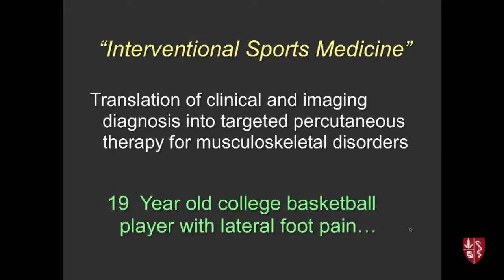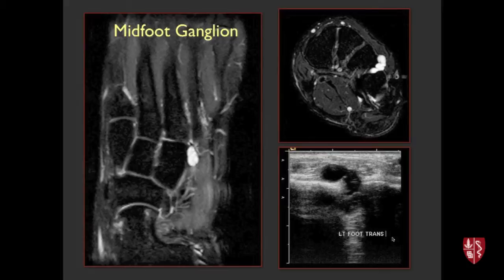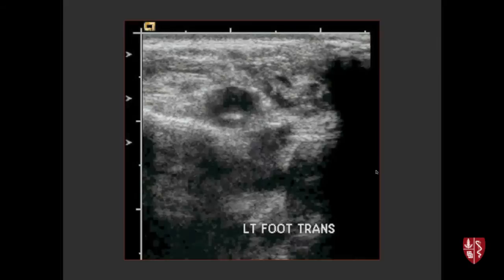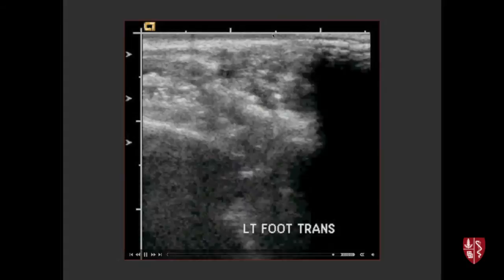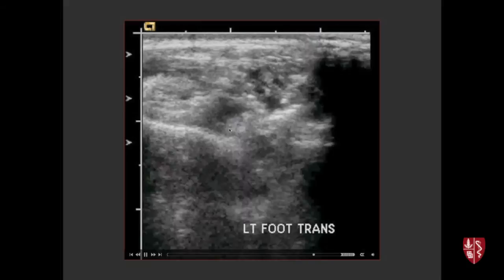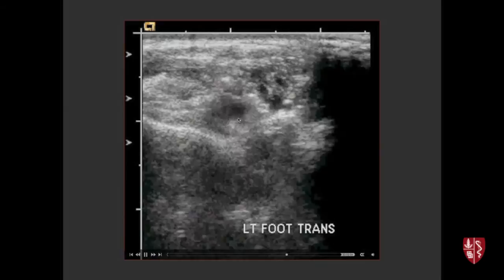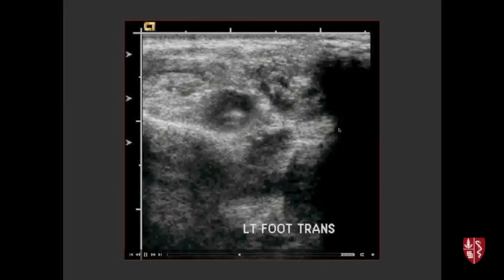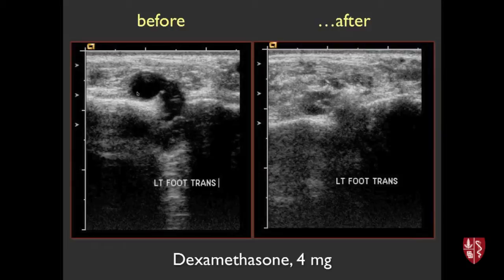Let's frame it up by looking at a case of a 19-year-old college basketball player with lateral foot pain. We did an MRI scan on her and found a small cystic lesion at the tarsometatarsal junction on this coronal T2-weighted MRI, and here it is on axial. We can see these types of cystic lesions well with ultrasound, so we offered to drain this cyst. The transducer is on the skin surface, here's the bone surface, here's the small cyst, and you can see the tip of a 25-gauge needle in the cyst — injecting some anesthetic, draining it, then injecting corticosteroids to treat potential inflammation. You can see before, the cystic lesion here, and after, much smaller, drained with some anti-inflammatory placed around it.